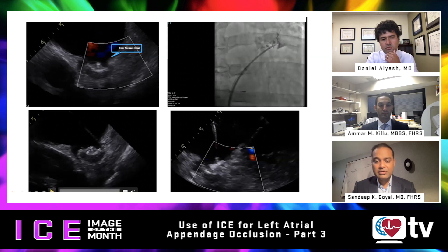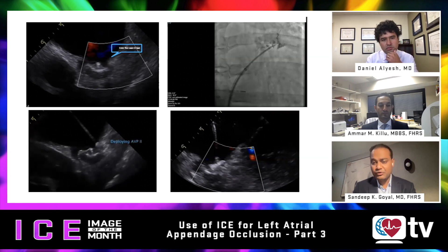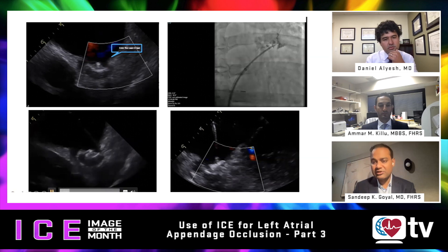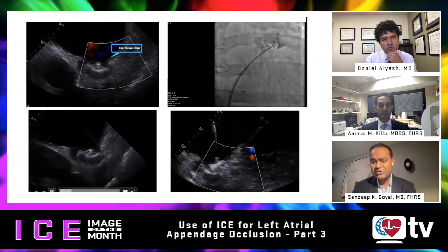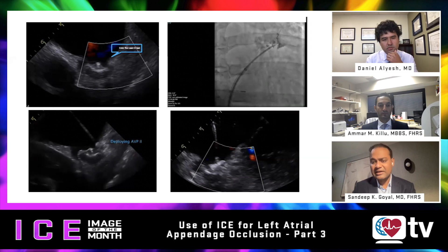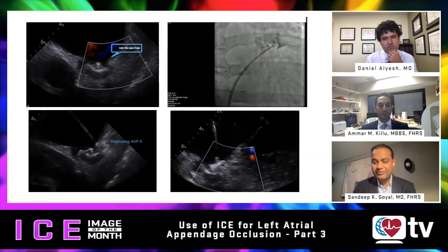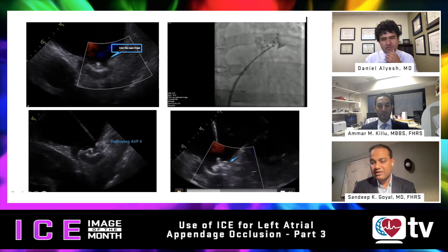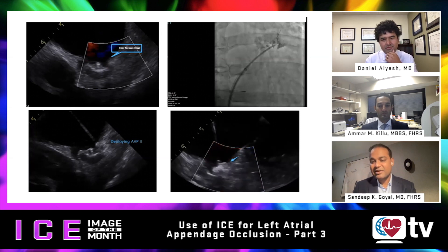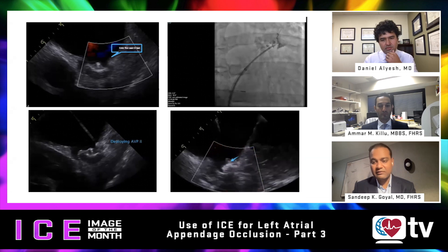Moving to panel three, an AVP2 plug is being deployed. There are several choices to close leaks — hydrophilic coils and various plugs. For this patient, based on the size and length of the leak, an AVP2 plug was selected. In this image you can see the plug partly opened as the sheath is being pulled back. Panel four shows the plug fully deployed, with the small echogenic disc visible near the face of the device providing a complete seal to the leak.